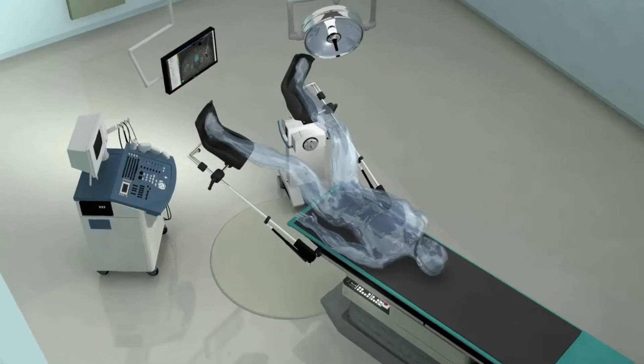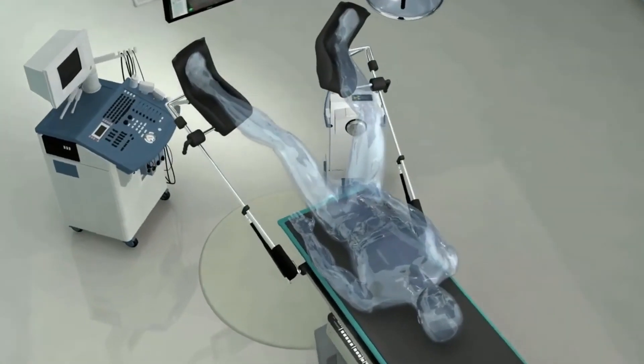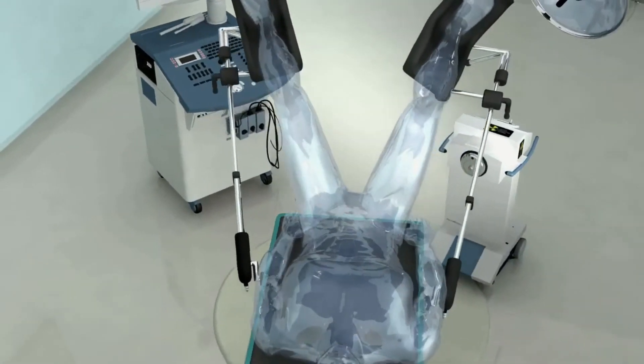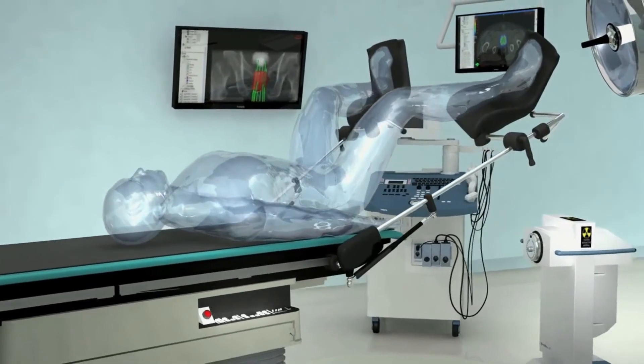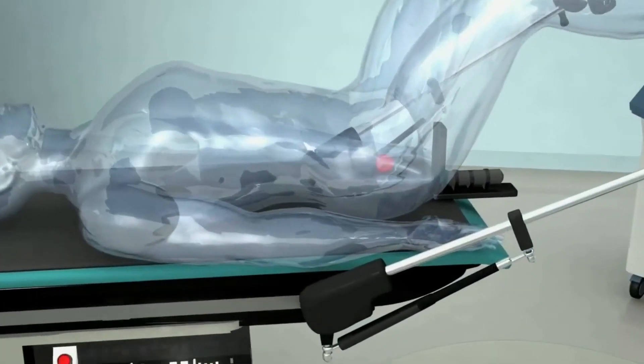High dose rate. HDR implants discharge high doses of radiation for 10 to 20 minutes. Your provider then removes the implant. Treatment times vary from twice a day for up to five days to once a week for up to five weeks.